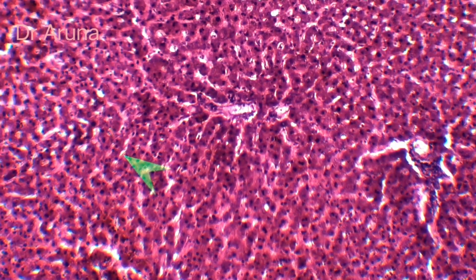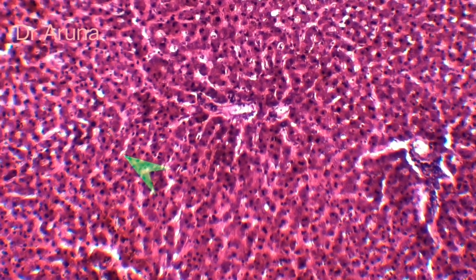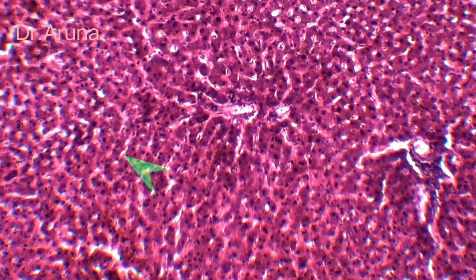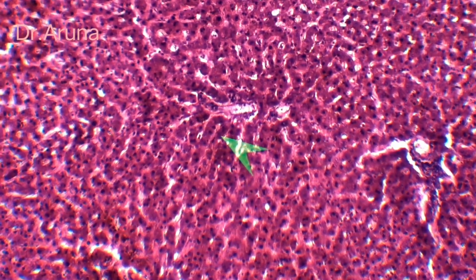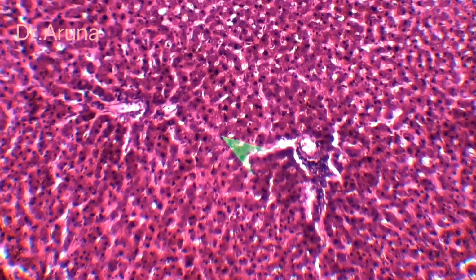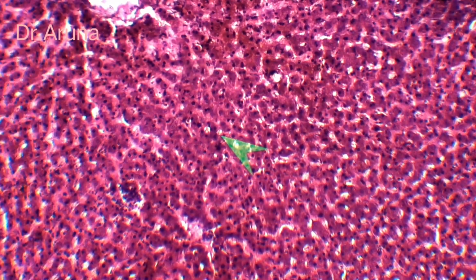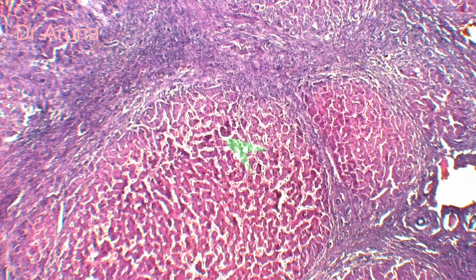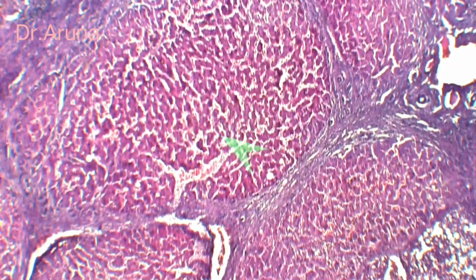Before moving on to the slide of cirrhosis, I will show you the histology of the liver. Just a glance view, this is the slide of the liver, and you can see all the hepatocytes are arranged in a trabecular fashion, and there is a lobular architecture. Now moving on to cirrhosis. So this is a case of cirrhosis of the liver. The entire liver parenchyma is converted into nodular structure.